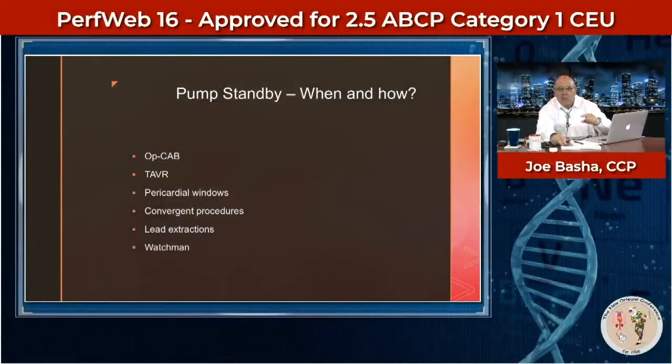Pump standby, when and how? So what do we do pump standby for? We do it for OpCab, we do it for TAVR, we do it for pericardial windows, we do it for convergent procedures, we do it for lead extractions, and we do it for Watchman procedures. So we do pump standby for a whole bunch of different things. The real question is, how do we do pump standby?